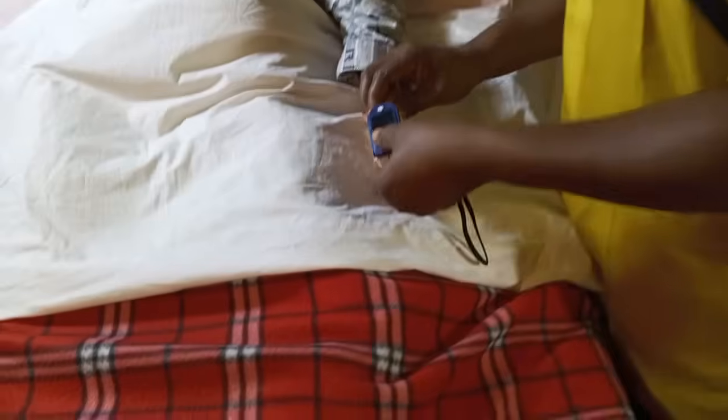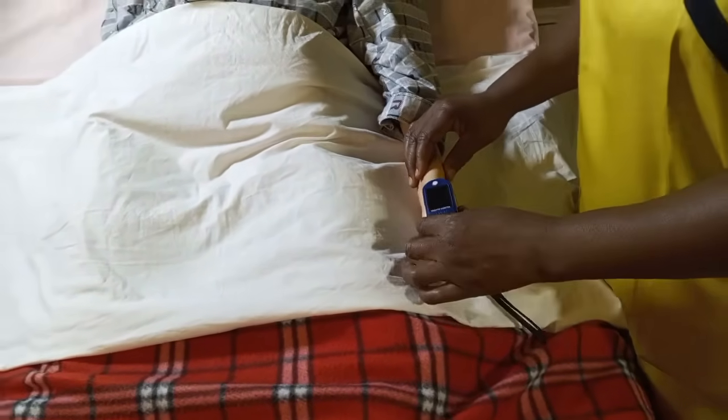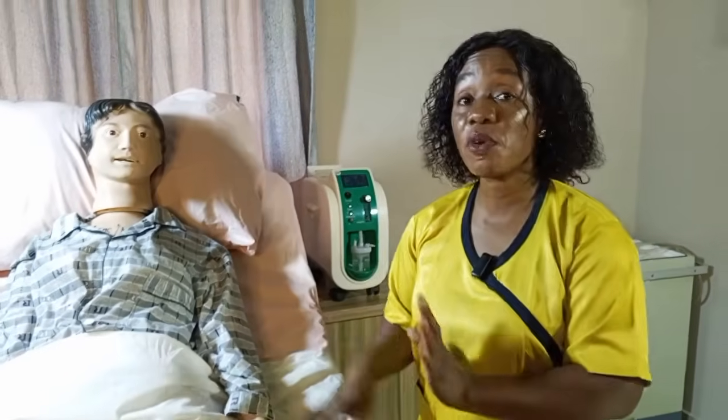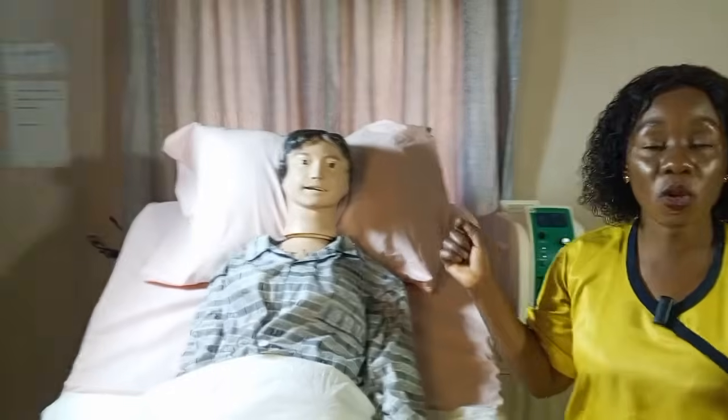Turn on the pulse oximeter using the button, then place it on the patient's thumb or index finger to take the oxygen saturation. Leave the pulse oximeter there to keep monitoring the patient's oxygen saturation. The next thing is to examine my patient's nostrils — to check for mucus, rashes, trauma, or bleeding. Before I touch the patient's nostrils, I have to perform hand hygiene and don my gloves.